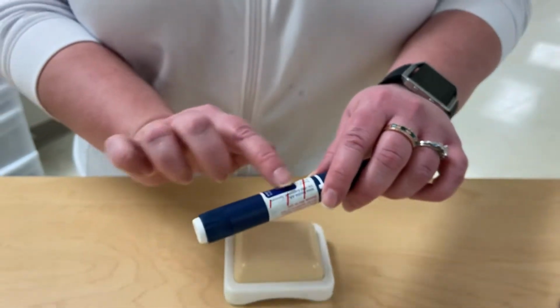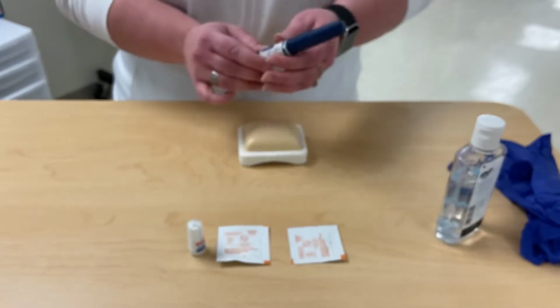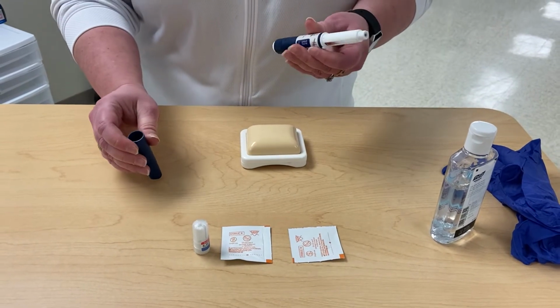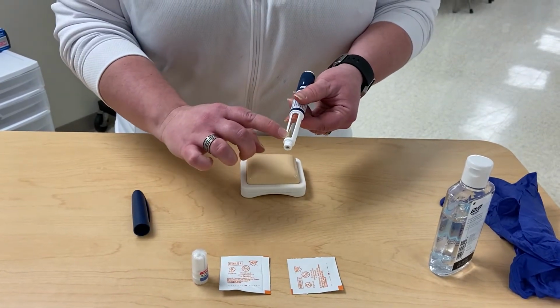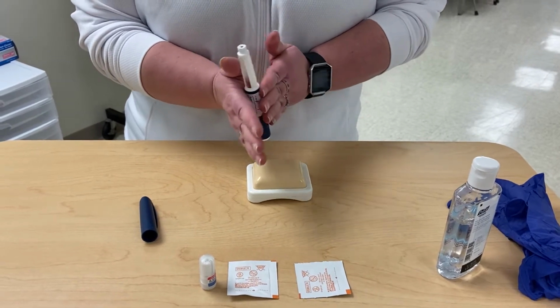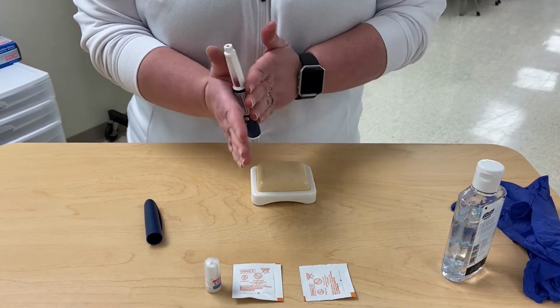So it'd be right about here on the insulin pen. And then we are going to take the cap off of the insulin pen, and we are going to observe if it's clear or cloudy through this area here. If it's a cloudy insulin, we're going to gently roll the pen between your palms 10 times.